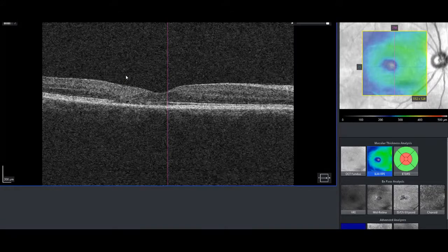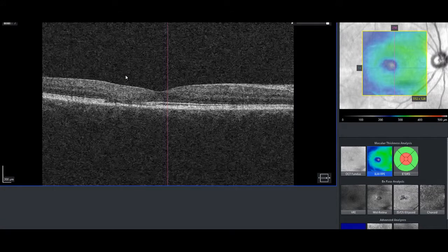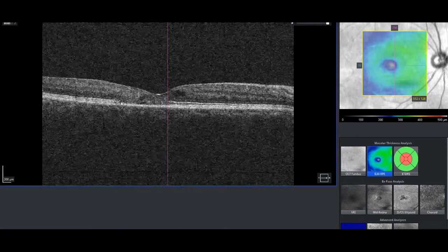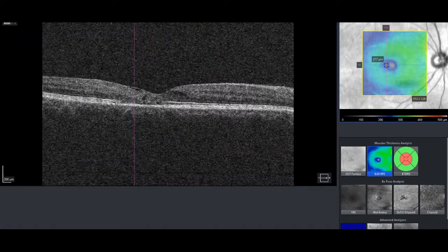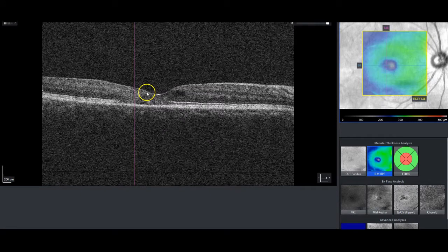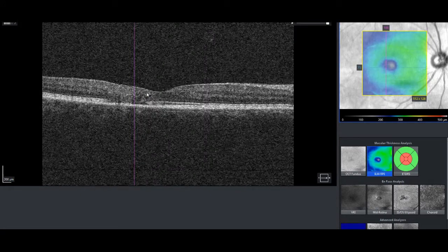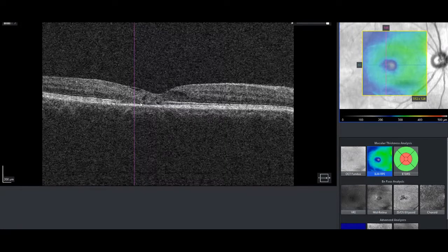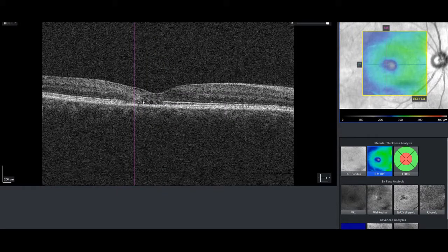We're just going down now through the fovea, continuing on the other side. Again, you can see. And what I can do for you is I'll actually bring the marker over so you know where it is. And where is that in the eye? Well, that's actually temporal to the fovea. So there's your fovea, and just temporal to it, you've got this abnormal area that I submit to you is more cavitation as opposed to fluid. And it's a fairly typical picture that we see with this diagnosis.